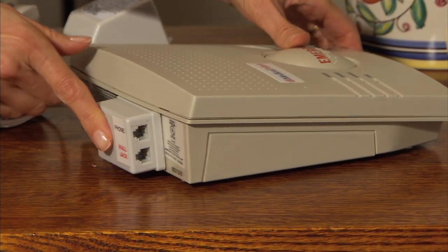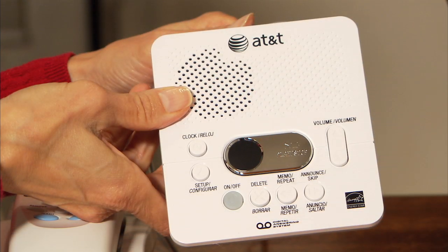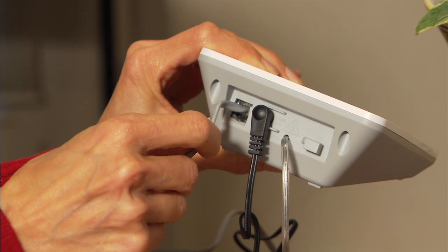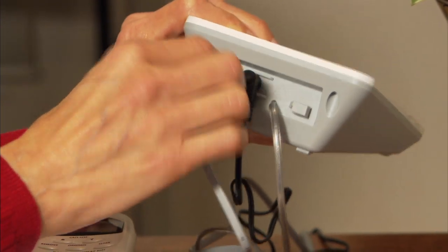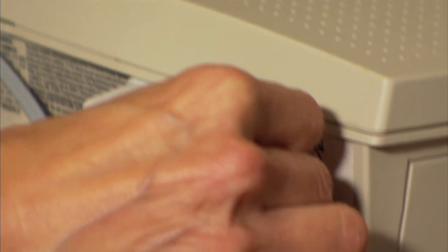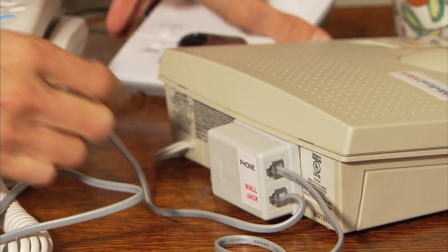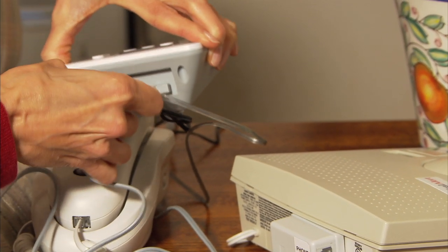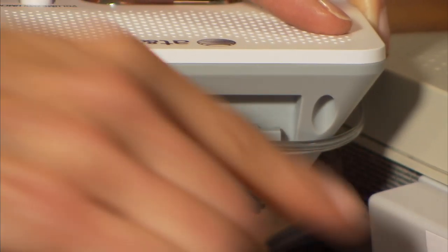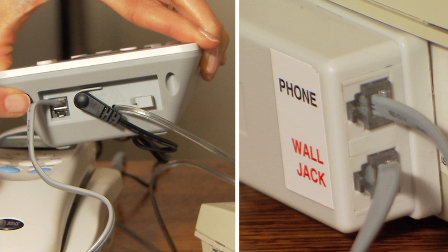Now, locate the small white phone line adapter box on the back edge of your new base unit, marked phone in black and wall jack in red. Next, locate the phone wire that is attached to your phone wall jack and runs to your existing answering machine or caller ID device, making sure it is the one with the plastic clip on the end. Squeeze this tab and remove the wire from your answering machine. Snap this wire into the port marked wall jack in red in the white adapter box in the base unit. Snap one end of the provided wire into the port on the base unit marked phone. Next, snap the other end of the new silver phone cord into the open port on the answering machine.